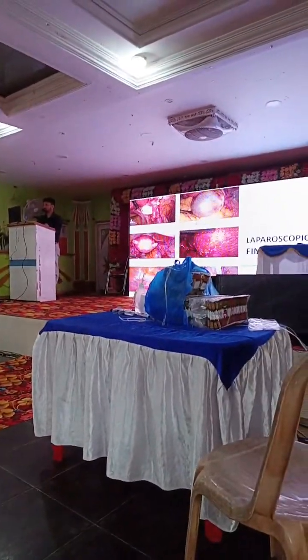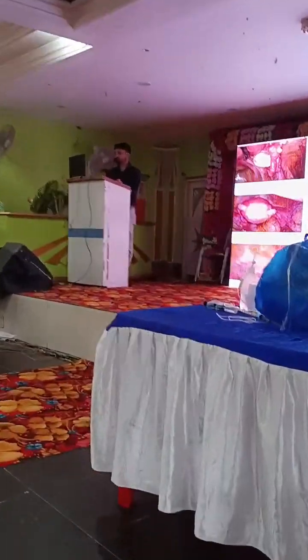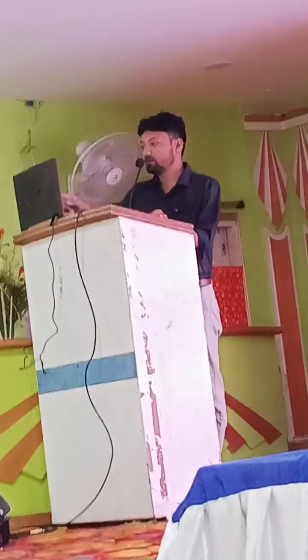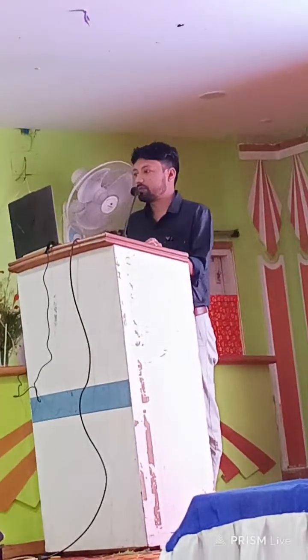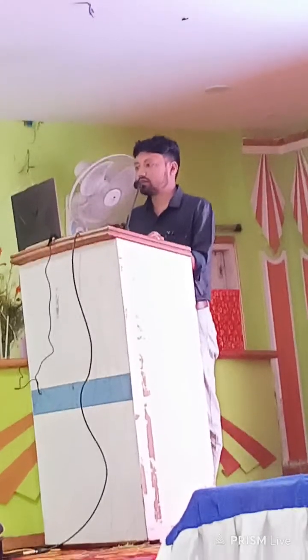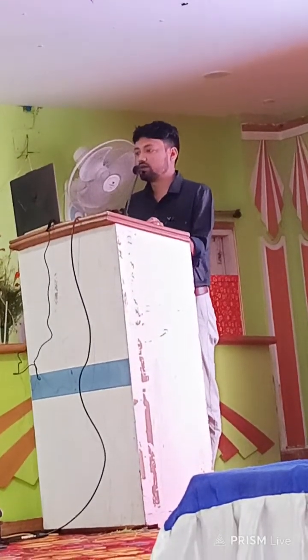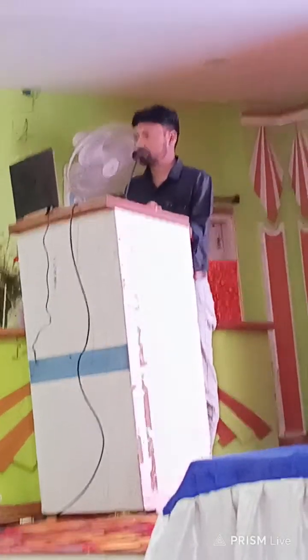So this is the laparoscopy finding. On the left side you can see a normal ovary, and on the right side this is the affected ovary. The left side is the normal uterus and the right side the affected uterus. And peritoneal involvement you can see. So what is the peritoneal lesion? Classical gunpowder, gunshot scarring, adhesion seen, red lesion and white lesion also seen.